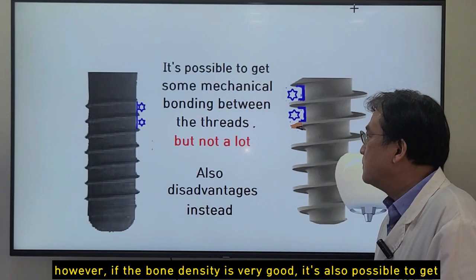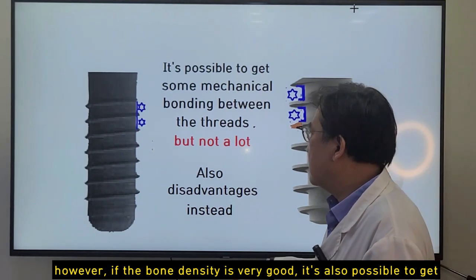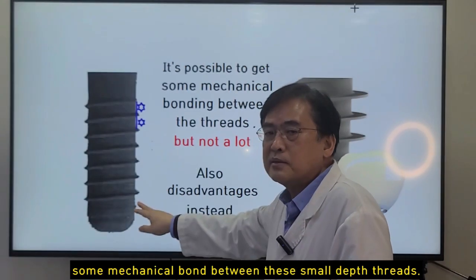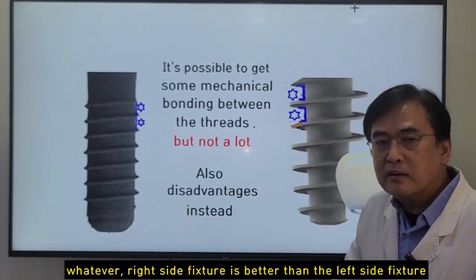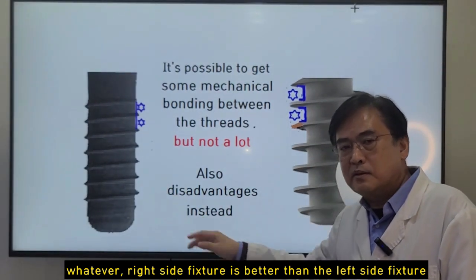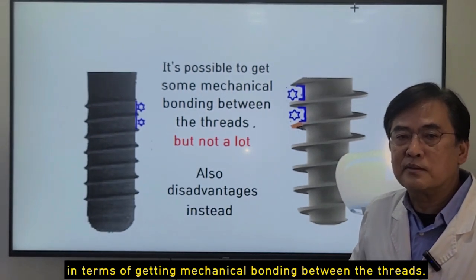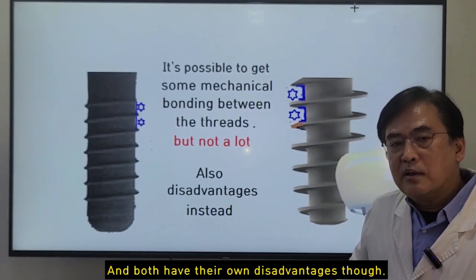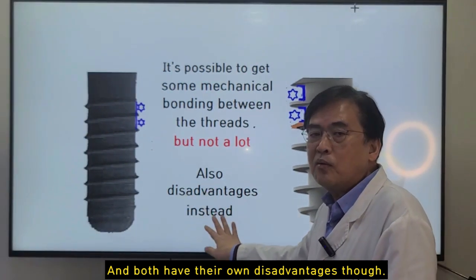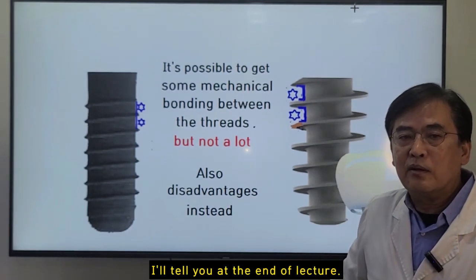However, if the bone density is very good, it's also possible to get some mechanical bonds between these small depth threads. Whatever, the right side fixture is better than the left side fixture in terms of mechanical bonding between the threads. And both have their own disadvantages though. I'll tell you at the end of the lecture.